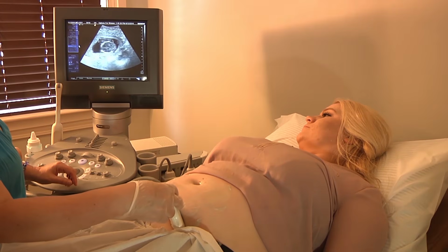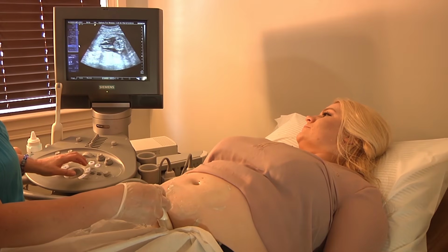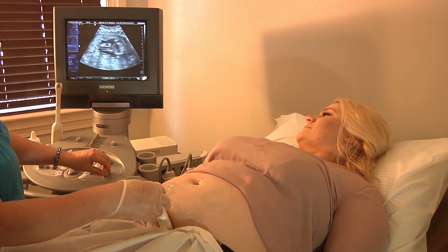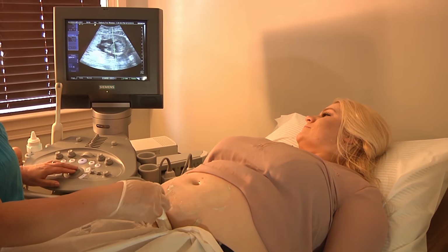Yeah, that's a bad picture, right? Well, now it's getting better. He's probably moved. Yeah. Okay, and there's now I've got the heart. Maybe I can make that a little bigger. And I have not done this guy yet. So make sure you get right in the middle of the valves. We're going to hear the heart now.